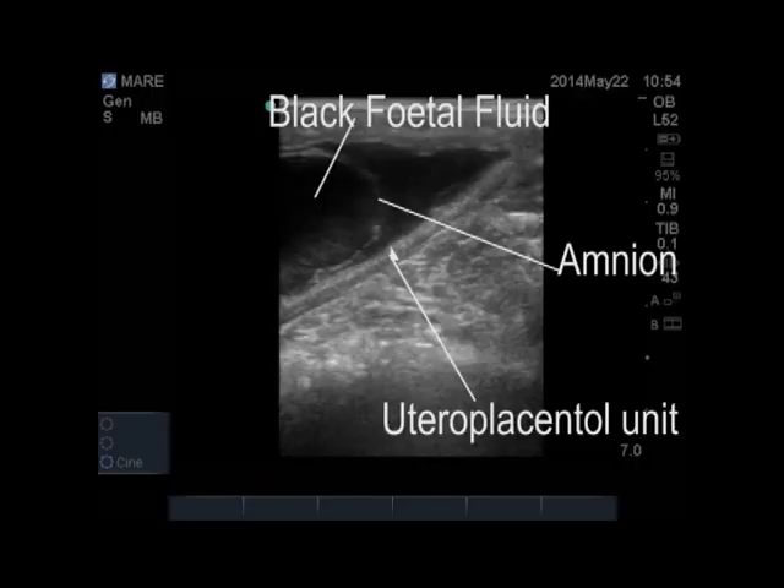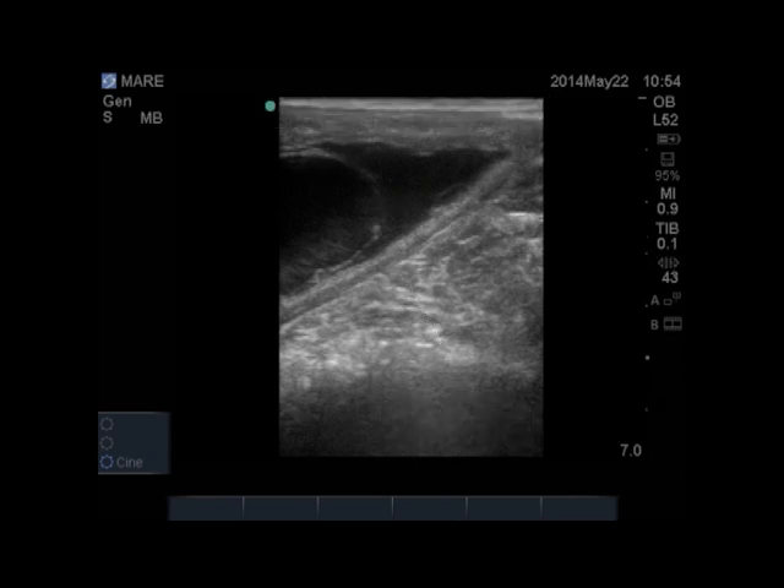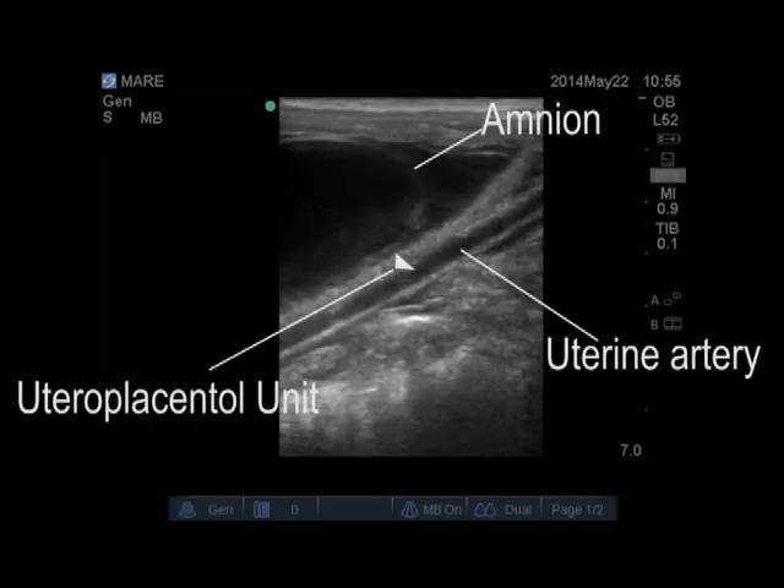This one shows a normal, healthy utero-placental unit — nice and thin. You can see the nice thin amnion floating; that's the little sac around the fetus, and the fluid around the fetus is nice and clear and black. This is completely normal. Again, just another picture which shows a nice demarcation of the uterine artery and the utero-placental unit running right beside it. This is the perfect image for measuring the utero-placental unit, and again, this one's completely normal.